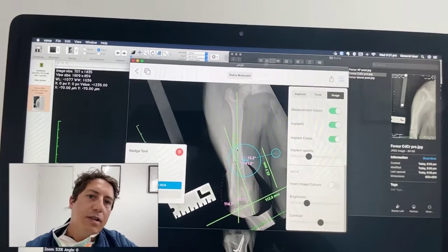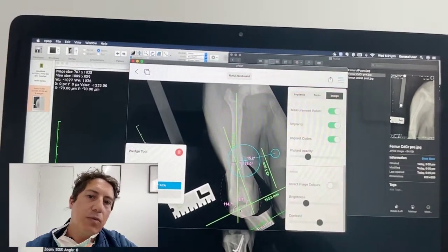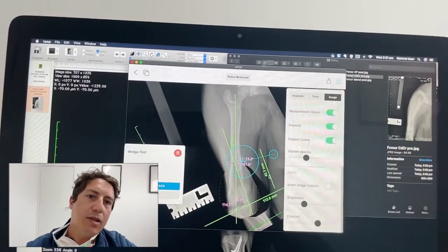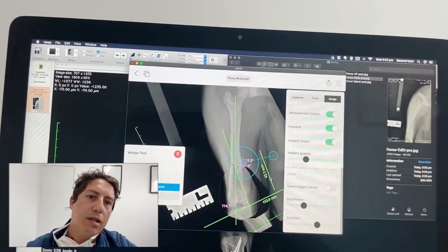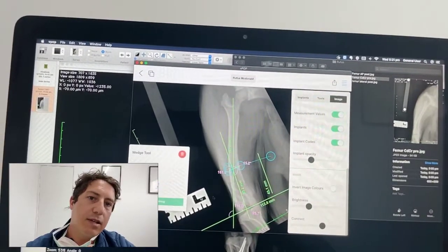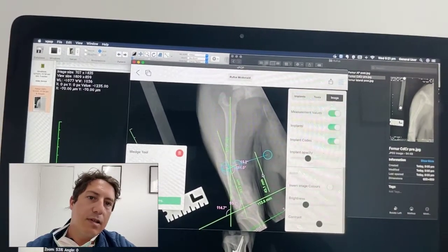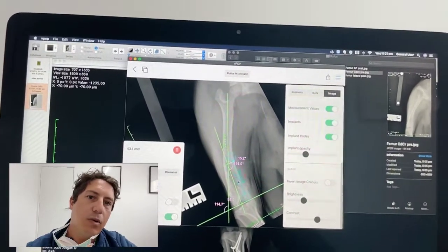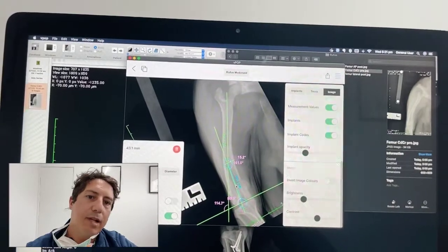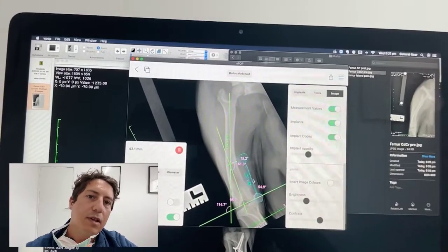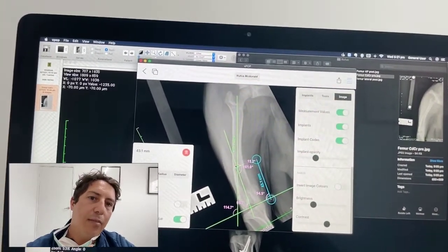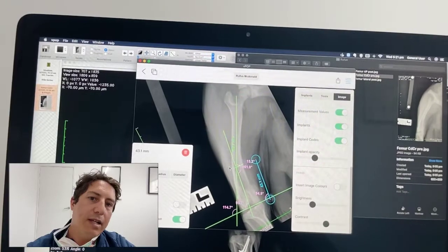So this was the planning we did to work out exactly where we want the wedge to be. We wanted it to be about 43 millimeters from the joint surface, and then we can measure how big a wedge we need to take out.